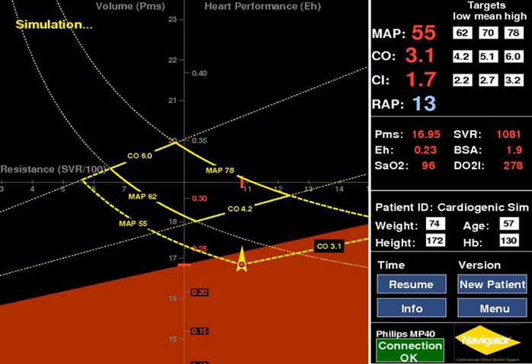Today I'll be talking about the Navigator Cardiovascular Clinical Decision Support Monitor and demonstrating some of its functions by using a case study of a patient with cardiogenic shock. I will start by orientating you briefly to the Navigator graphical display.